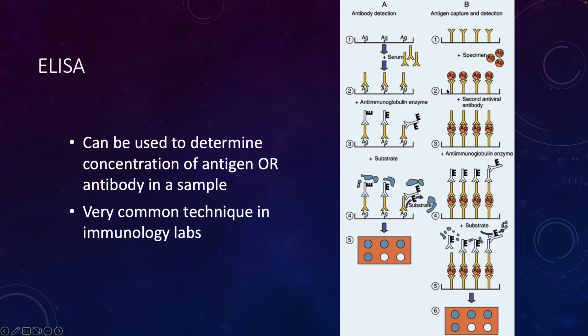So this is sort of how a COVID-19 test would work, and you've probably taken some of those. So what happens is there are antibodies in the little COVID tests. They call them a lateral flow assay because it runs horizontally instead of vertically. And so there's little antibodies in there, and as you swab your nose, you mix it with the liquid, you put it on the sample, and you let it run.